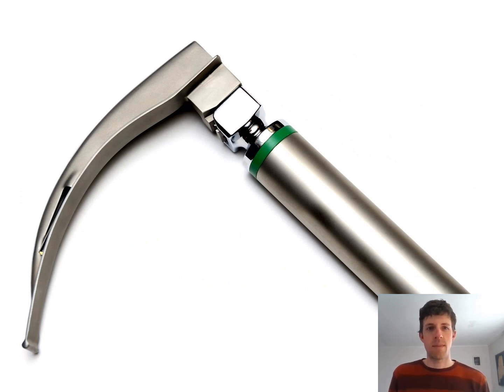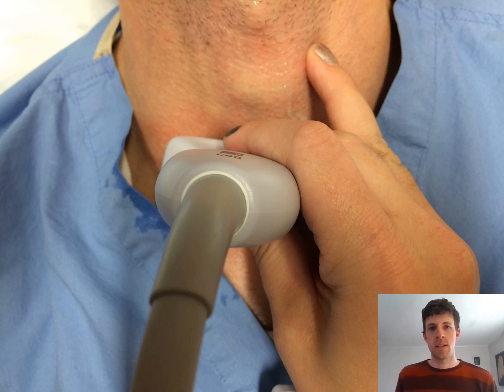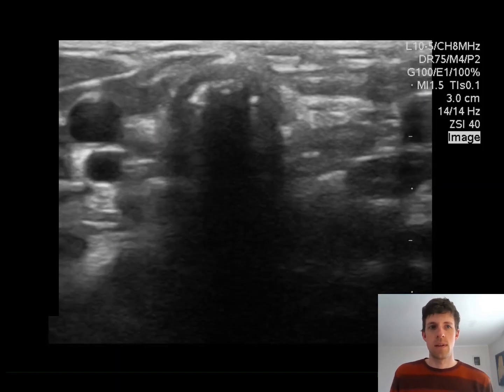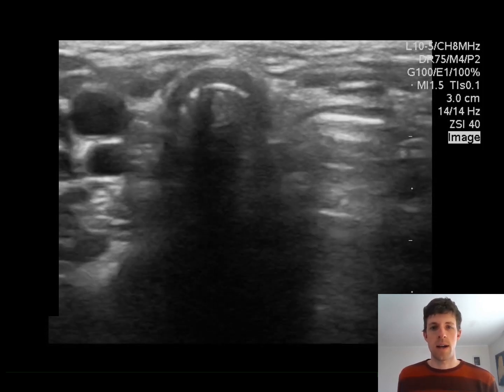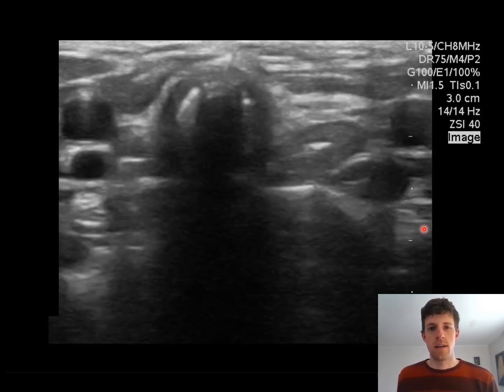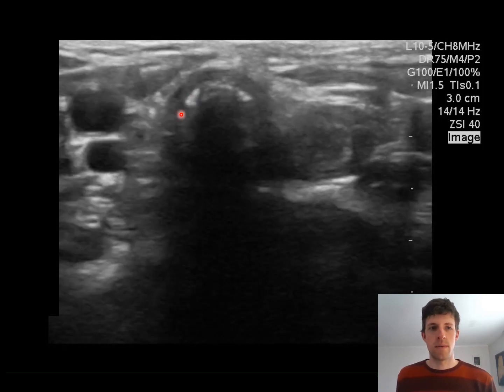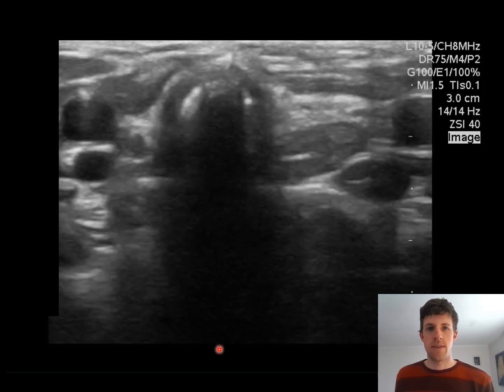Moving on to the second application for airway ultrasound, identifying tube placement after intubation. For this, you will orient your probe in a transverse position on the neck over the trachea. You'll get a cross-sectional image of the trachea with the carotid arteries on either side. Here you can see the trachea right in the middle of the screen. The air in the trachea is creating this shadowing artifact.